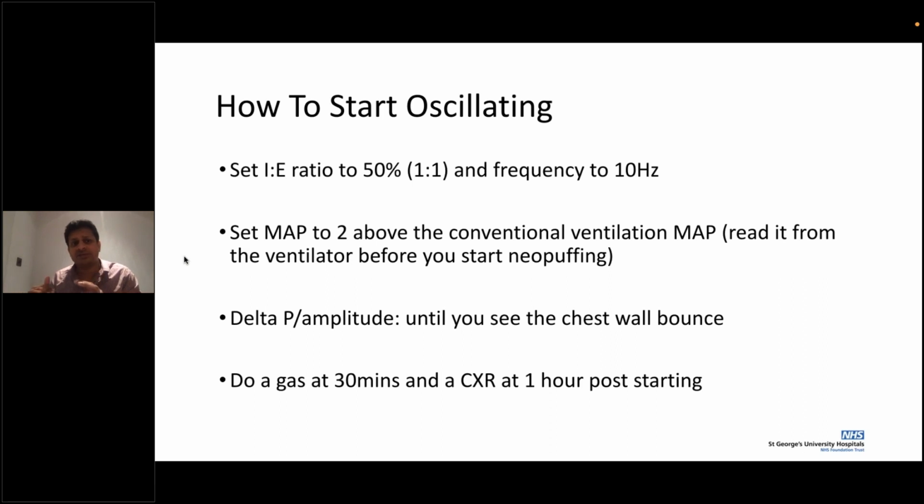And amplitude generally will be roughly 2 to 3 times your mean airway pressure. Another way is basically to look at the chest bounce. If the chest is not bouncing, then you're not giving enough amplitude. And consider increasing the MAP if you're going beyond 3 times the ratio of your mean airway pressure. So if you're at 15 of MAP and 45, and yet you need an increased amplitude beyond that, you may need to go up on the MAP to 16 to achieve that.